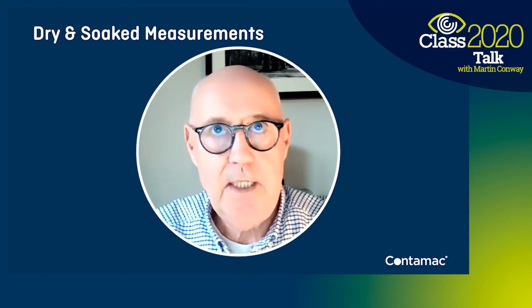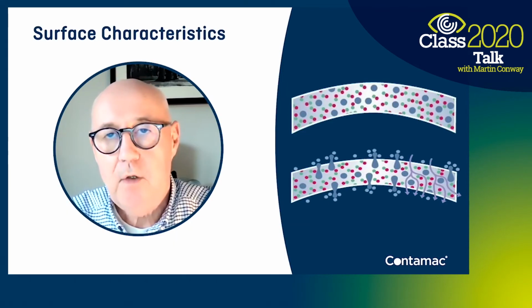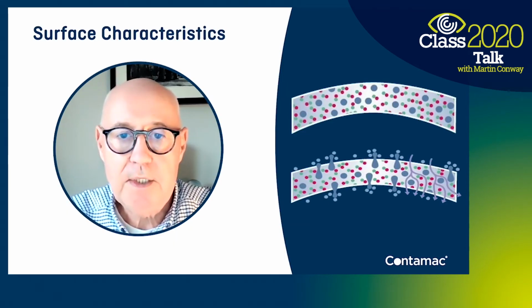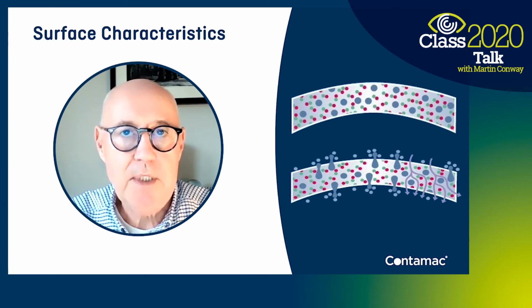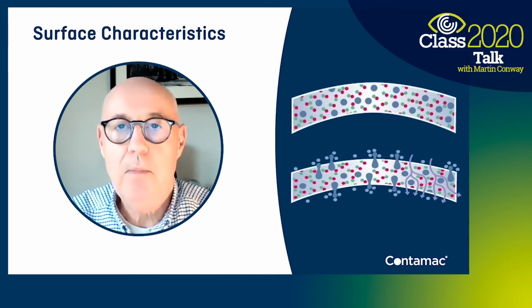A lens is inert, it doesn't really change, but that's not the case. If we look at the slide below here, we can see that a modern GP material will contain up to 10 or more different monomers.